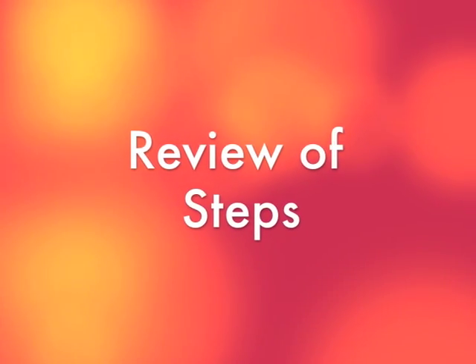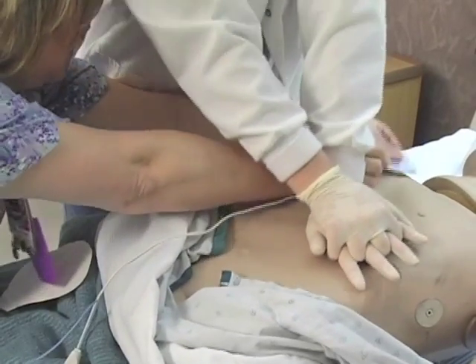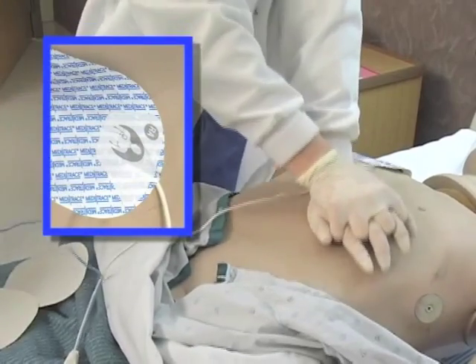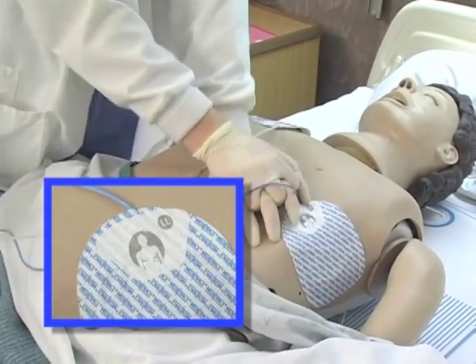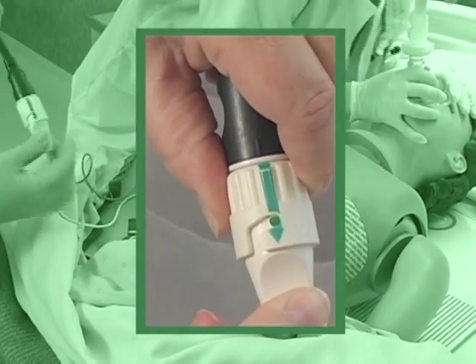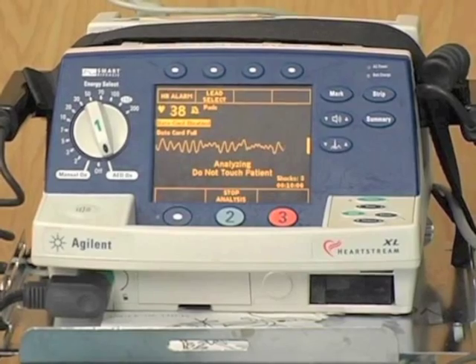Let's review the application and use of the AED one more time. Apply the pads to the right upper and left lower chest or anteriorly and posteriorly as shown on the pads. Remember, do not place the pads over an internal pacemaker. Connection between the pads and the cable on the AED goes green to green. Turn the knob on the AED to AED on and press Analyze.